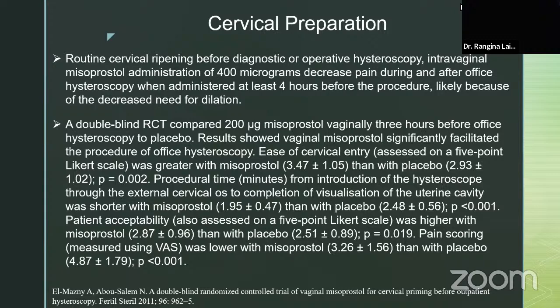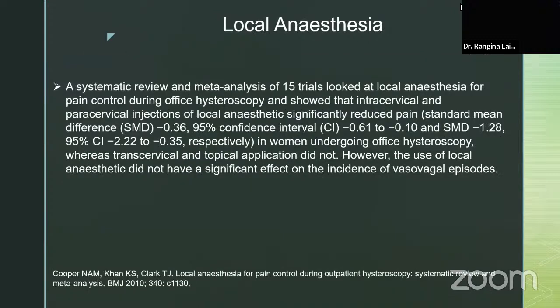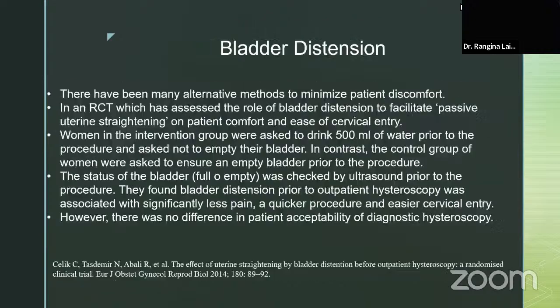There are lots of studies which support 400 microgram, and lots of studies which say we should put 200 microgram. About the anesthesia part, there are many doctors doing office hysteroscopy without anesthesia. I personally have not done any cases as an office procedure. I always do all my procedures under IV propofol, short anesthesia.